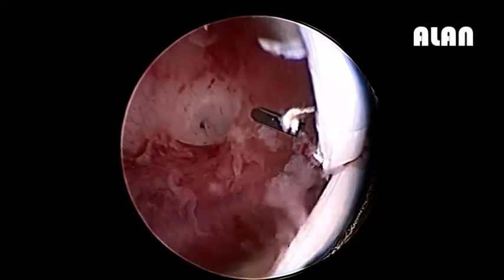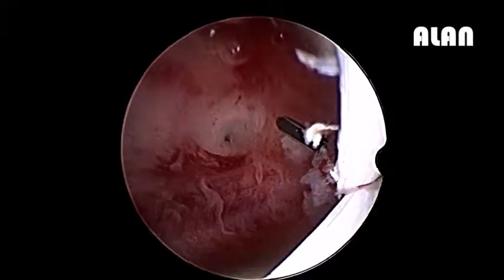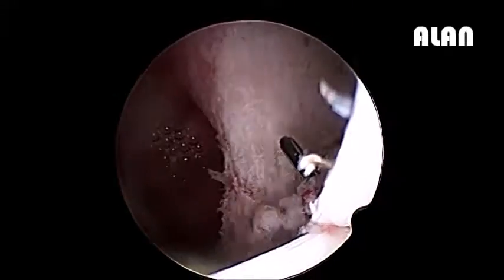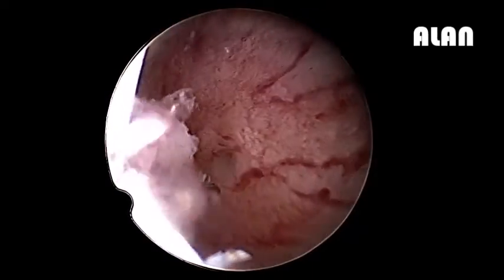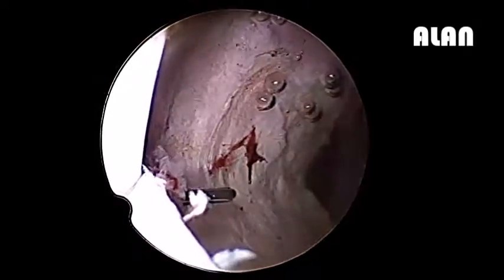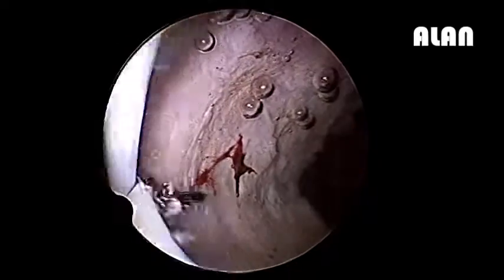Can you see this is the right ostium there? Yes, you can see very clearly, sir. And then when I withdraw my telescope you can see this septum now? Excellent. And this is the left one — I will show the left ostium also. Can you see the left ostium? Yes, very clearly seen. Even if we correct it completely and looking at all the criteria, one criteria will not match — that is both the ostia at the same level.